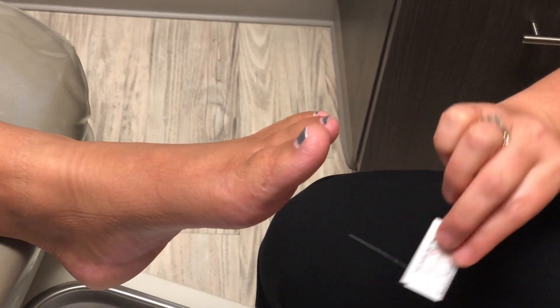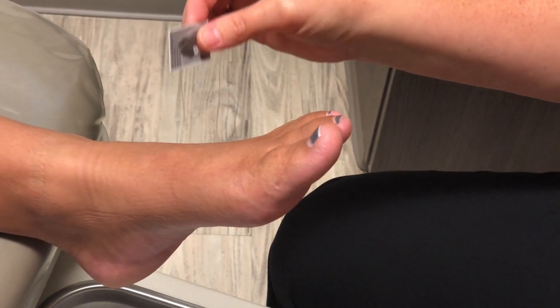This was first invented by Florence SEMS and Sidney Weinstein years and years ago. They actually used it to test patients who had brain deficits to see if they had hand sensation. And we can still use it on hands, but in our clinic, we use it on feet.